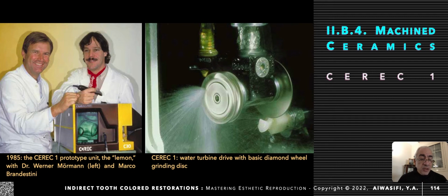innovated by Dr. Werner Mörmann in Switzerland and Marco Brandestini, who was a dental lab technician. The right photo shows the saw or water turbine that cuts or reshapes your blocks, and how much water coolant is used to avoid any cracks in your final restoration due to heat generation.